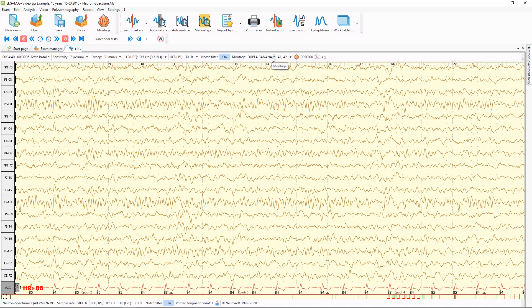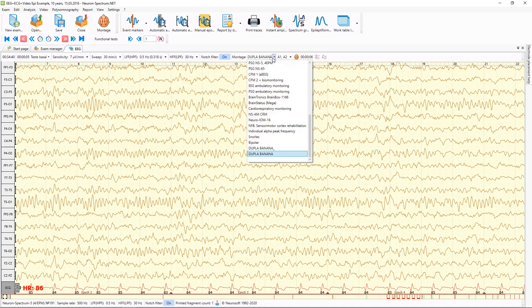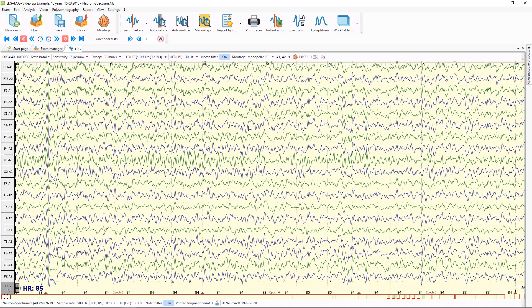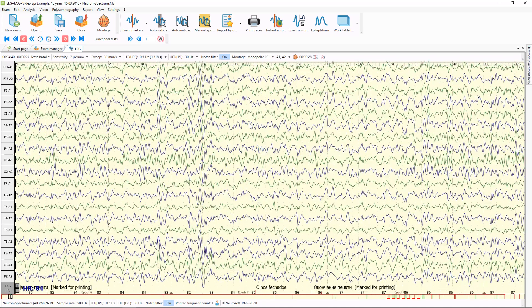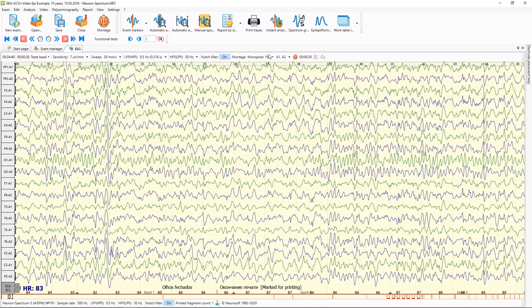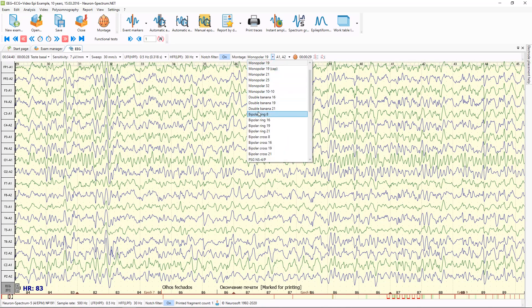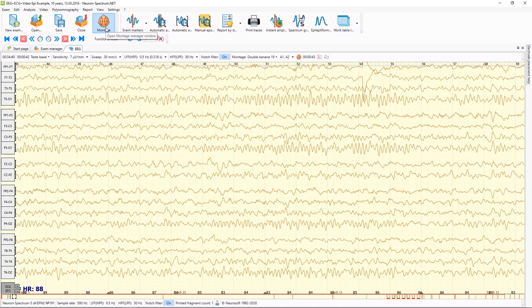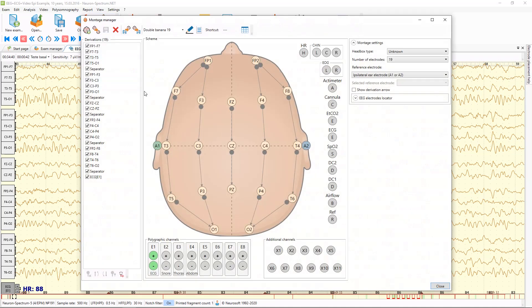As you know, you can change montage during reviewing and also during recording EEG with this drop-down list. And using the Montage Editor window, you can set up your list of montages.